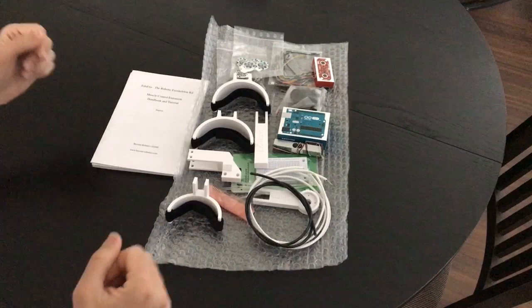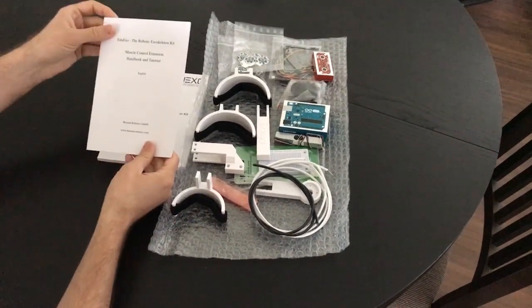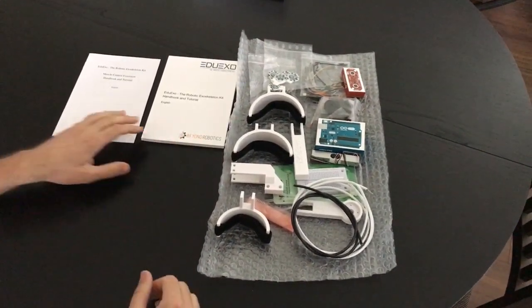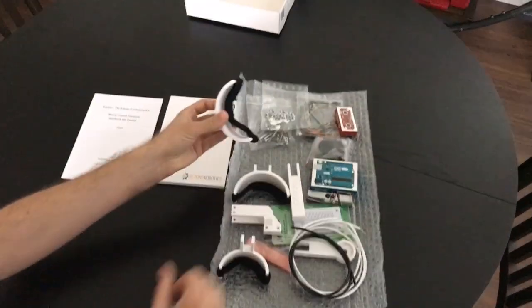These are all the components that you get in the EduXU kit. You have the short handbook, the guide with the history and the overview of the exoskeleton industry, and all the hardware components, which are 3D printed.